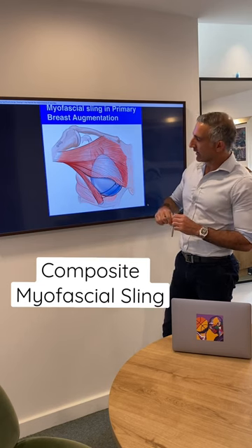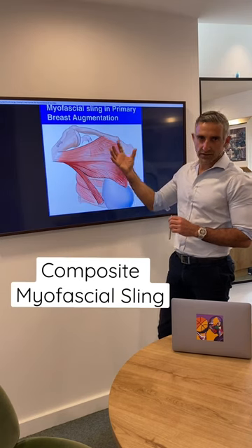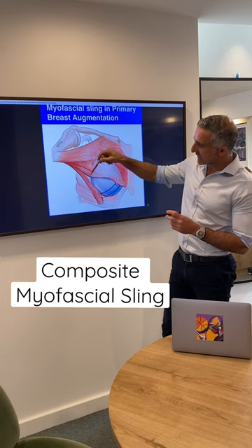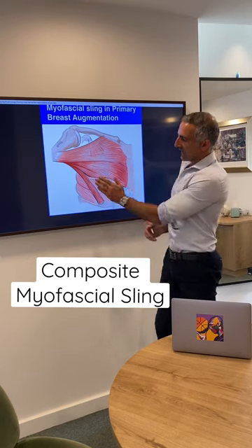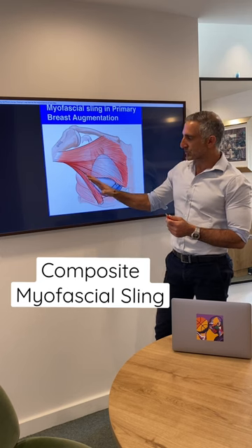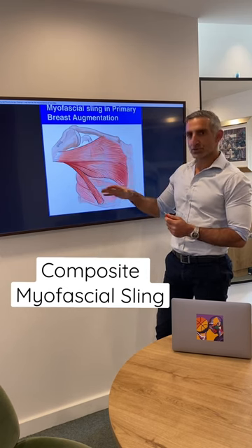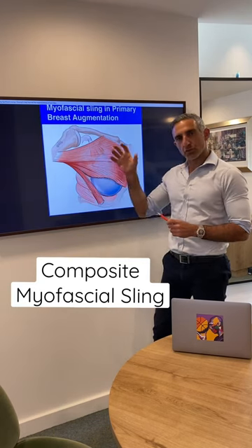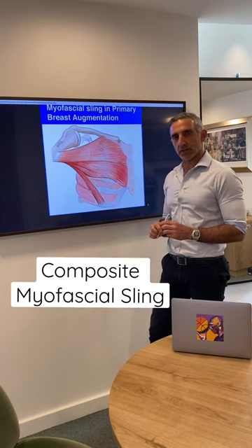How does it work? As we all know, there's the pec major muscle, and when we do our dual plane pocket, we put the implant underneath the pec. In our technique, I take a sliver of the lateral pec and a little bit of the serratus fascia and have that as a little hammock for the implant. By doing cable sutures from my composite myofascial sling, both medially and supramedially, I create a little hammock for my implant to avoid the dreaded complications of infralateral migration of the implant.